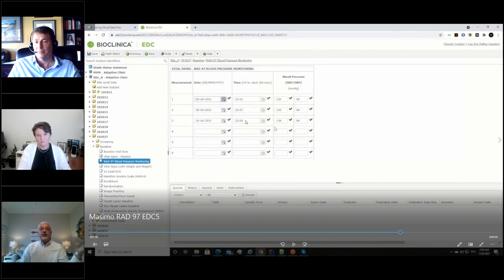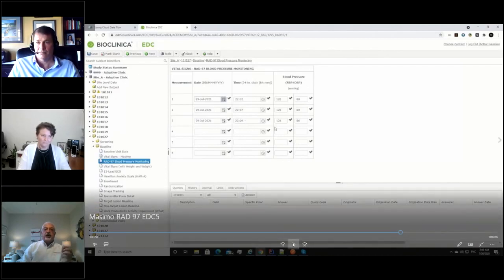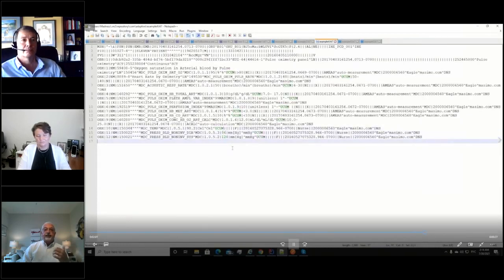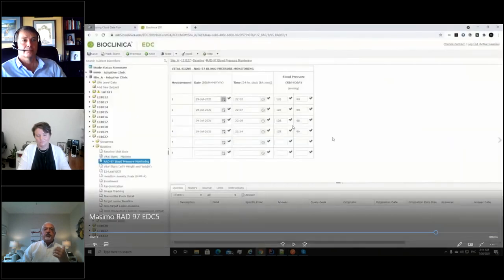So the Masimo device is constantly feeding data. It's the filtering, right? The filtering is, okay, every 5 minutes, everything is fine. Oh, I saw an outlier and it was only 2 minutes later. So this constant filtering is important. Now imagine that. You now know exactly when the blood pressure fluctuation happened here. Now the same thing with SpO2 or the CO2 or any sort of cardiac monitoring or EKGs and ECGs. So here now it's 128/86. It's stabilized. So we flip back to every 5 minutes sampling.